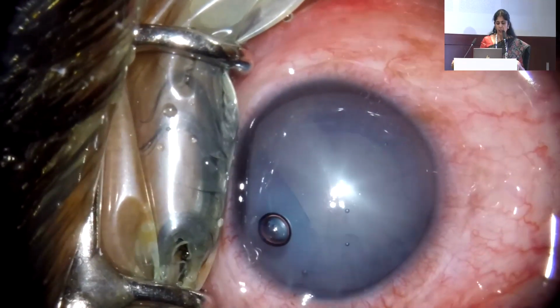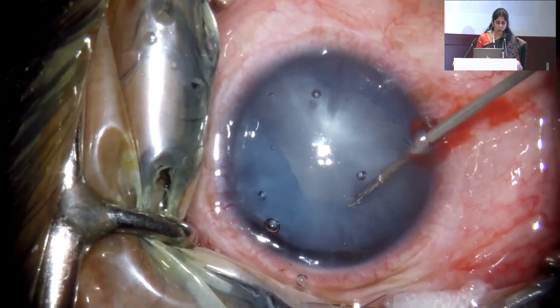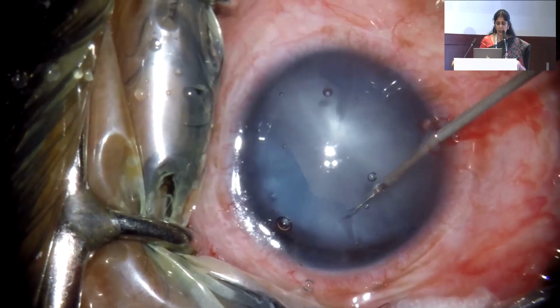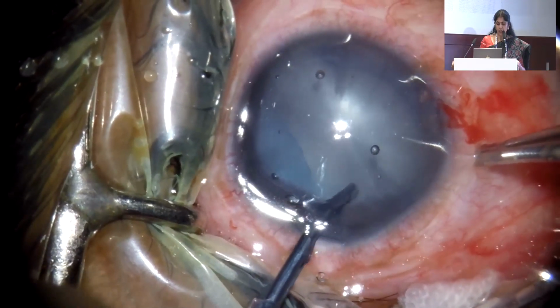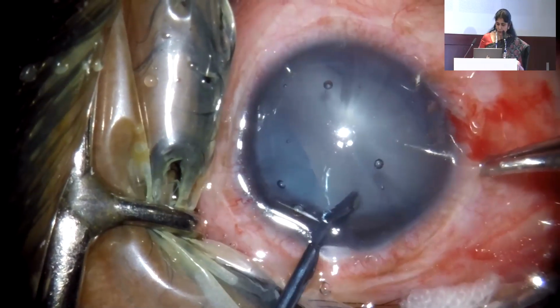Now, having the rexus done at two points, it still is okay to continue with phaco, but please remember we don't have an intact rexus. One can either go in through the main incision or go in through a paracentesis and make these micro nicks with this micro forceps, and then make a larger opening in the anterior capsule and continue with phacoemulsification.